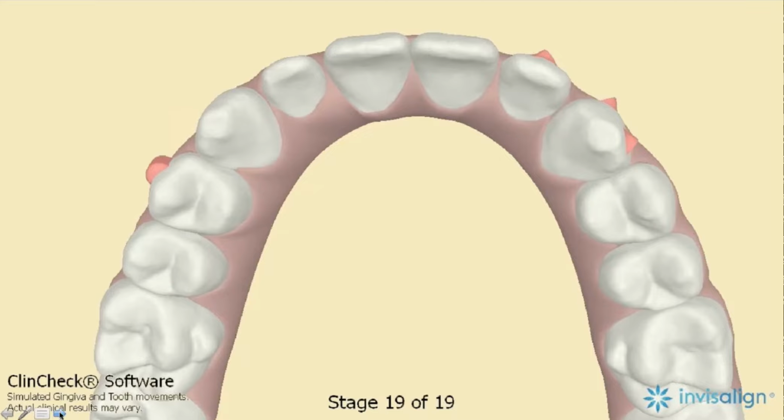So now we have space around there. Now, you can leave the lateral teeth in the middle of the space if you want. Most of the time, I'm going to put the lateral right against the centrals so that when I restore, the papilla that's more visible between the centrals and the laterals, more visible than between the laterals and the cuspids, is a little bit more natural. It doesn't have any shadowing there. So I'm hiding that shadowing by putting it a little bit more distal. So normally I'll put those laterals against the centrals and leave the entire space distal to the laterals. In this case, it's distributed equilaterally.